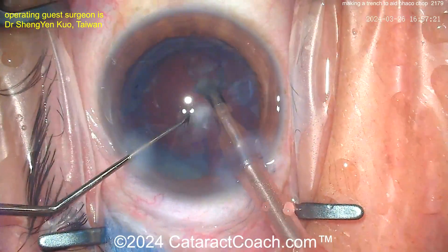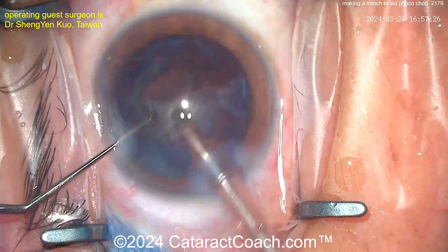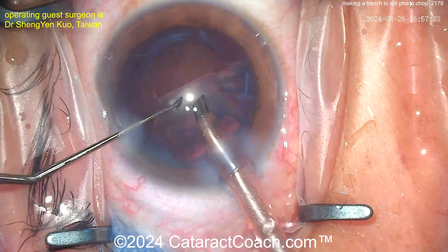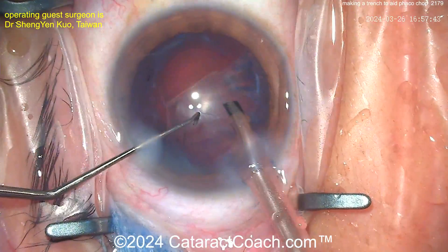Here comes the epinuclear shell — just get that to flip over on itself and get it out of the eye. Look at that — beautiful! What a nice case. Let's finish watching this case and see what we get at the end.